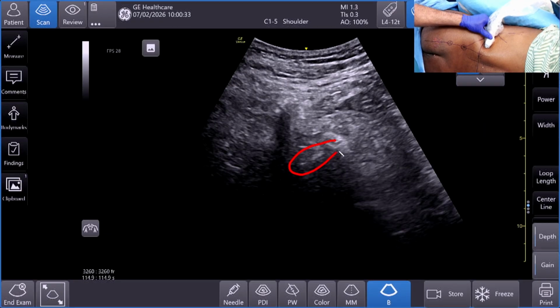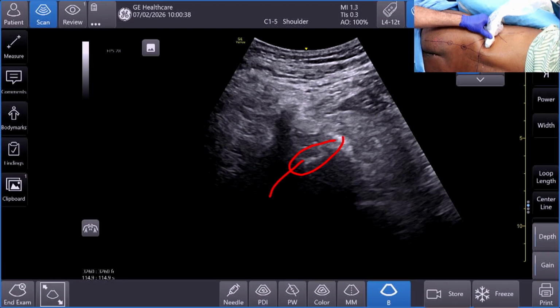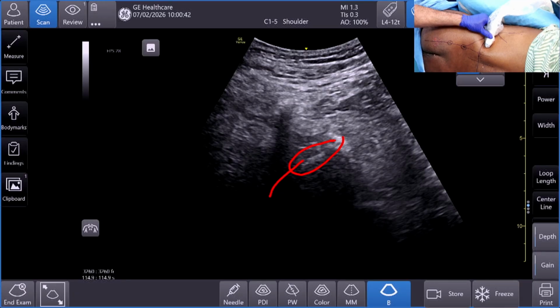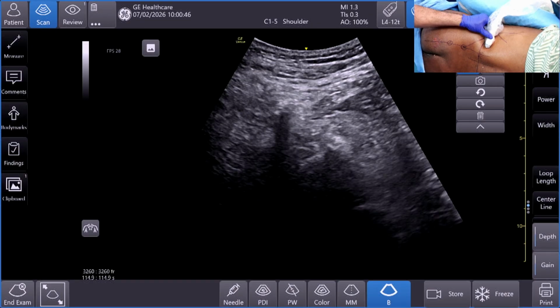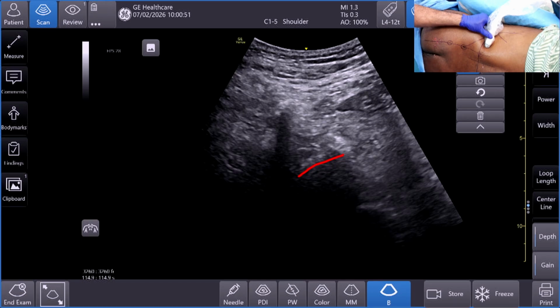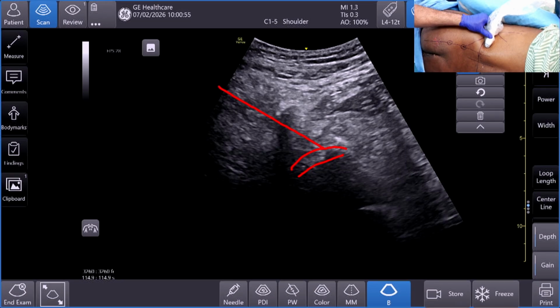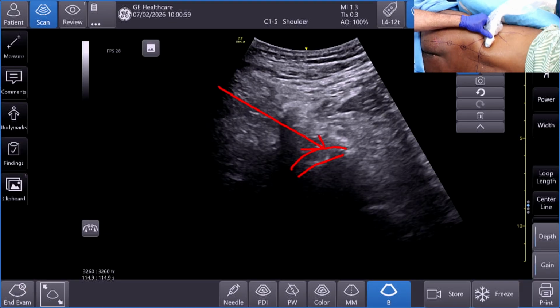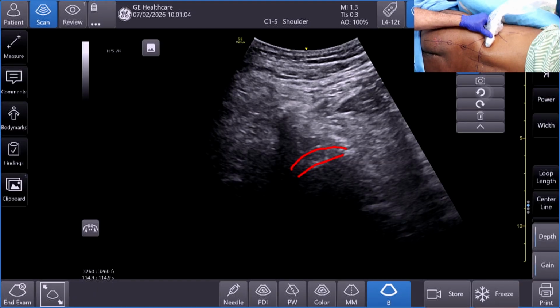This one, which is emerging from the intervertebral foramen, could probably be the lumbar plexus. Please remember, you can see that it is pulsating. It means that the lumbar artery is usually placed here. Next will be the lumbar nerve, and your needle is going to be closely positioned to the lateral aspect of the lumbar root. So that's how usually the topography is.